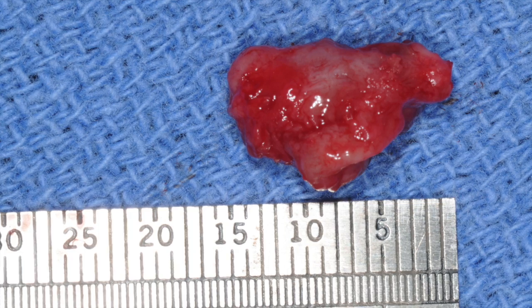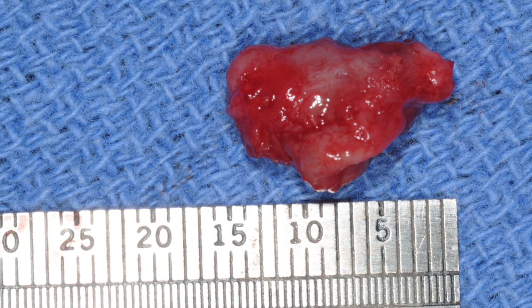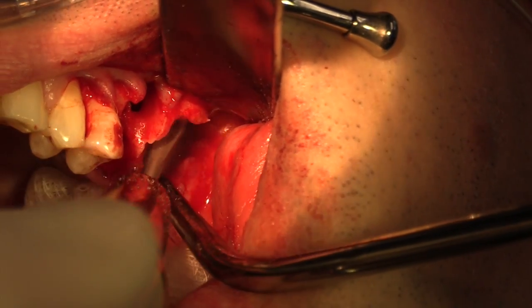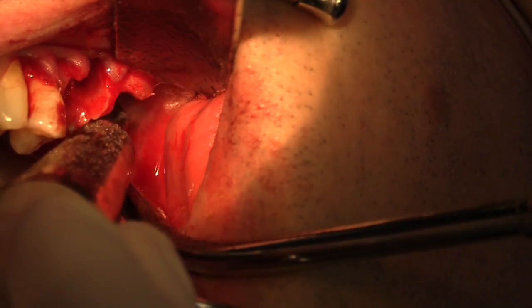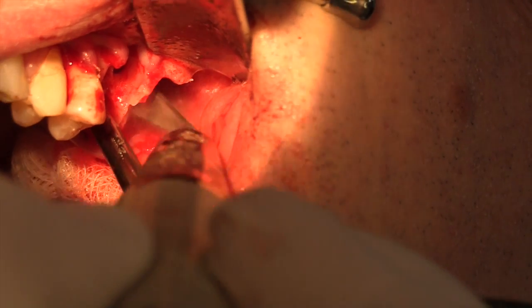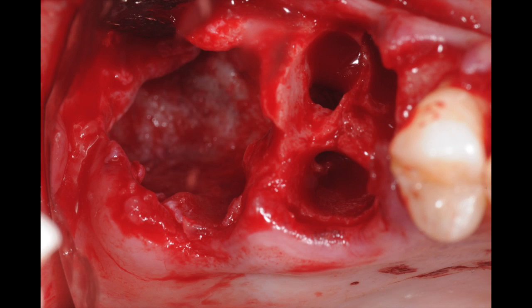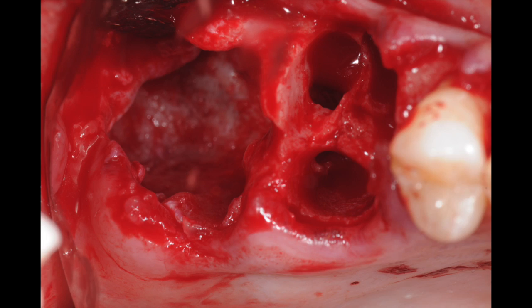Alternatively, a Carnoy's solution has also been used for this purpose. For the peripheral ostectomy, I'll use the piezotome, which allows effective access to the cystic wall for gentle ostectomy while avoiding perforation into the sinus. And if necessary, one can also use a large round diamond burr to access the difficult areas. Here's the site after the peripheral ostectomy has been completed and now ready for grafting.